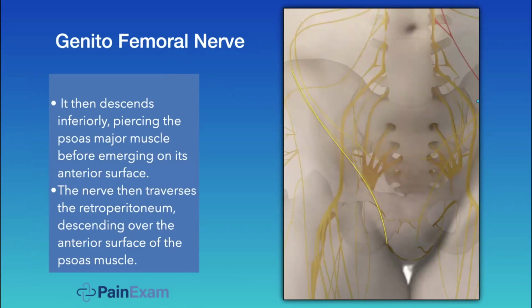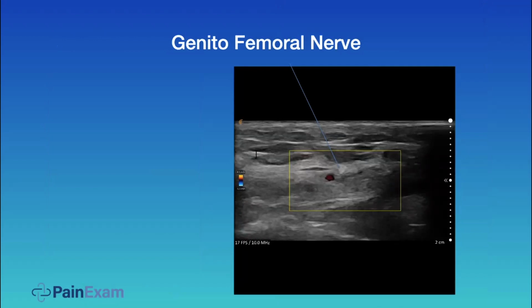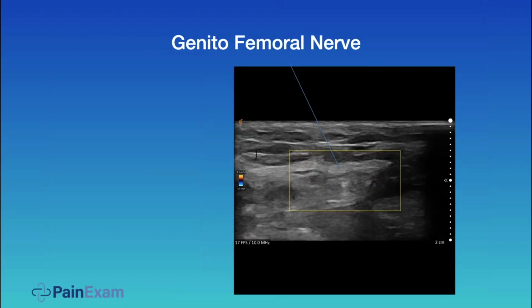I typically block this nerve when I'm treating a patient who's had a hernia repair and has persisting pain radiating to the testicle. And it's either the genitofemoral nerve, the genital branch of that nerve, or it's the ilioinguinal nerve that's entrapped. I usually will just do process of elimination, usually by a physical exam. You could tell by their complaint, by where the tenderness is, but sometimes you can't, and you need to do a diagnostic nerve block. So here's an image of the nerve.